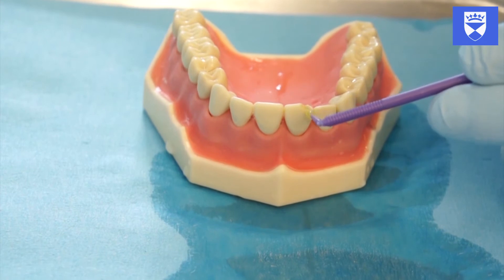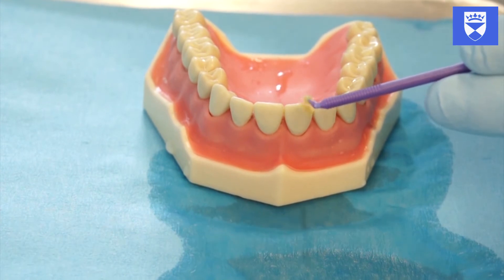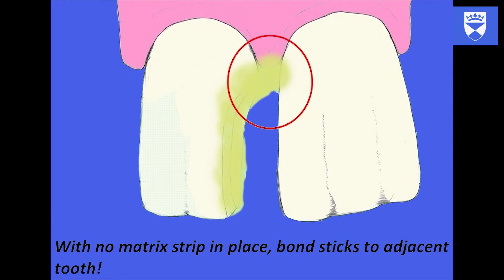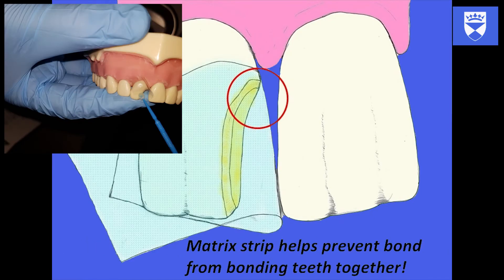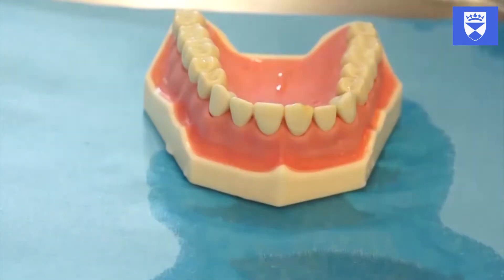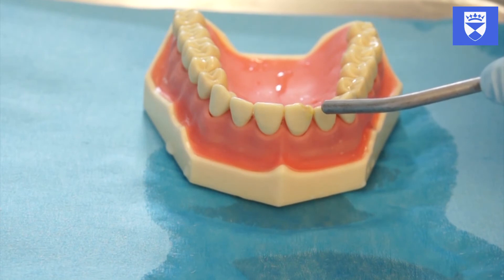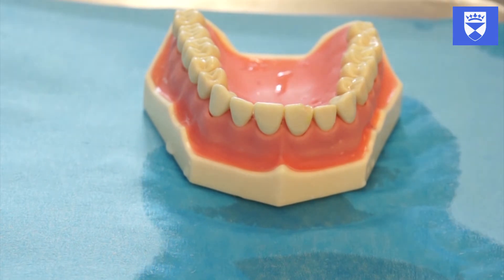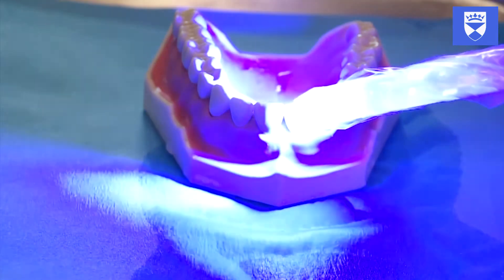Apply bond to the exposed tooth surface. Allow this to soak into the tooth for 20 to 30 seconds, then air thin. Light cure the bond.